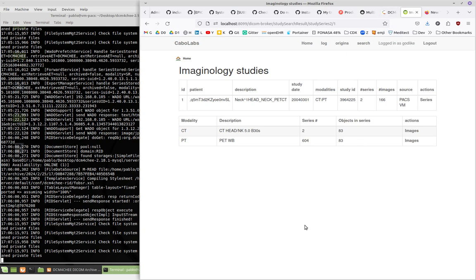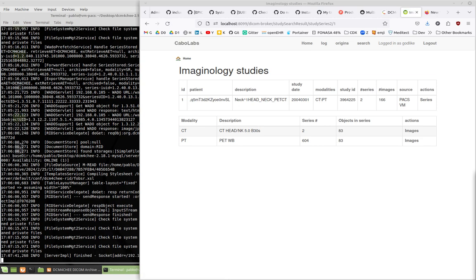So yeah, the only missing thing here on the application, I can just stop the application and run the application again and see if I do the search again, if it finds the structure report. Right now it's running again.